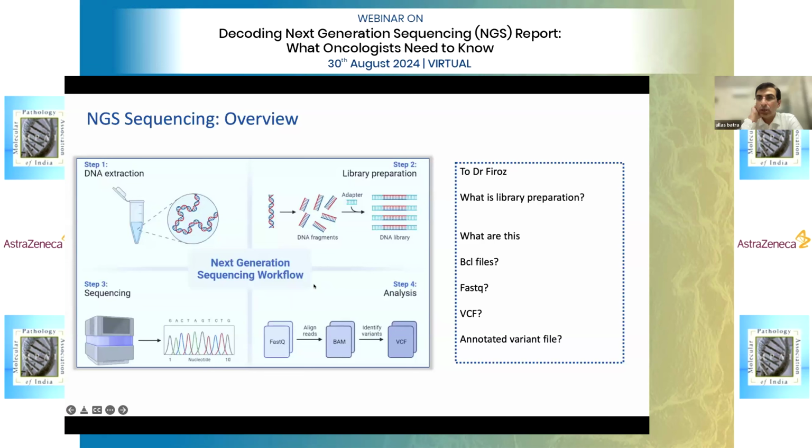Okay, fantastic. So it's about the quality. So there are 2 points, doctor, here, because I do get these kind of questions and I actually want to clarify this. Pre-analytical, there are 2 points. One is the amount of the tissue and one is the content and the quality of the tissue. So tumor content and the quality of the tissue, these 3 aspects.